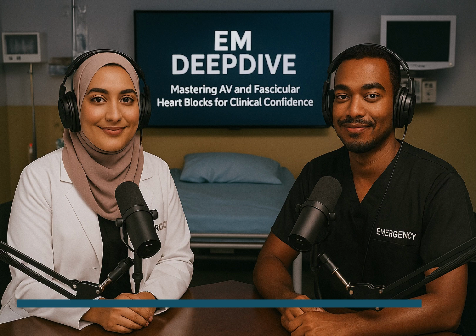Wow, what an incredibly detailed and really practical deep dive into AV and fascicular blocks. We've gone from the subtle prolongation of a PR interval in first-degree block all the way to that complete electrical chaos of third-degree block. And we learned how spotting axis deviation with a bundle branch block can immediately point you towards a fascicular issue. Absolutely. And I think the key message, the big takeaway for you listening is always correlate your ECG findings with the patient's actual clinical picture.